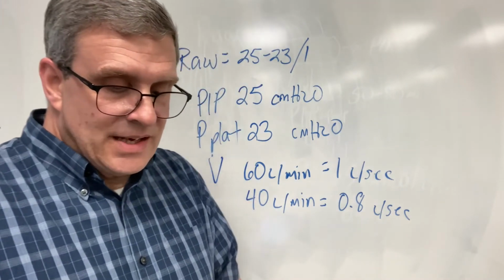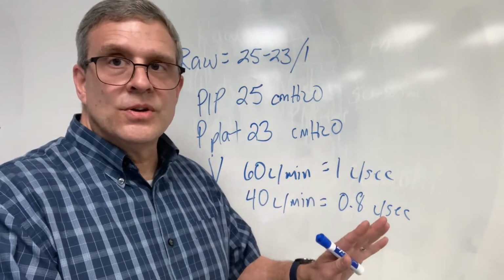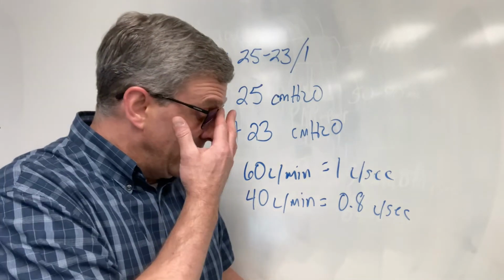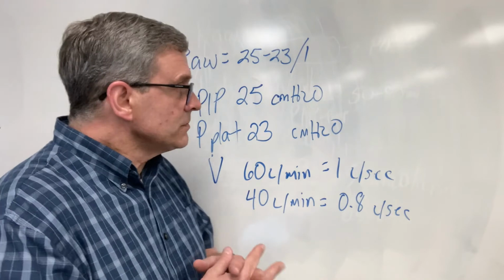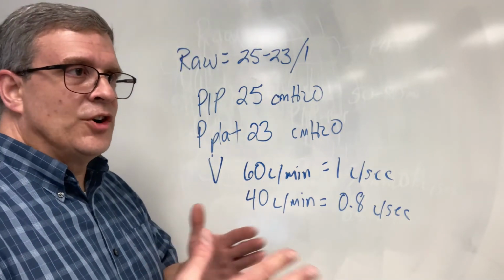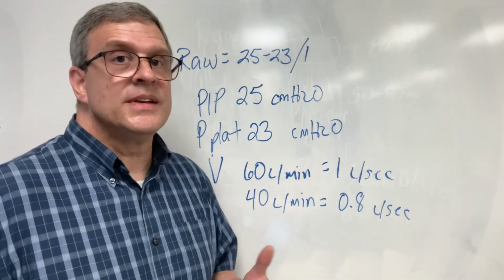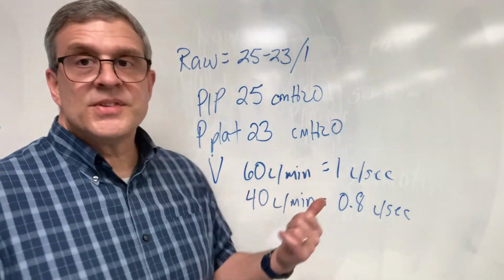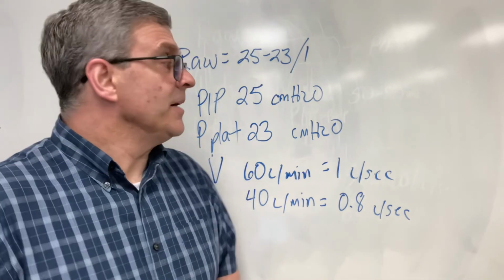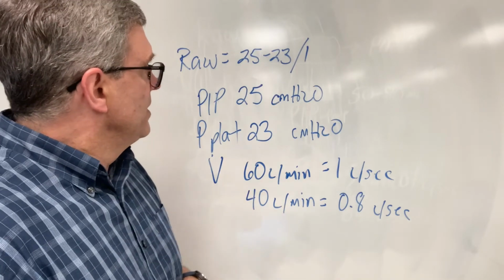And that's important at the bedside because when you have a patient who's got a high peak pressure, you're walking up, taking care of your ventilator, and pressures are going into the 40s or higher. That's concerning. And so you can grab a P plat and determine whether that's a resistance problem, a compliance problem, or both, because they have different solutions. If it's a resistance problem, then we're going to start looking at, do they need a bronchodilator? Do they need suctioned? Are they biting the tube? It's another cause. Lots of different things.